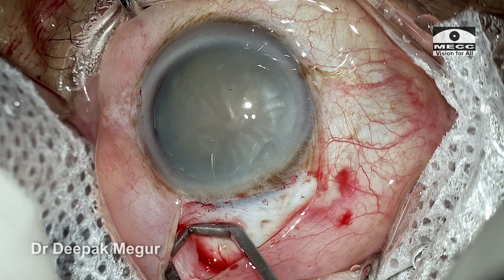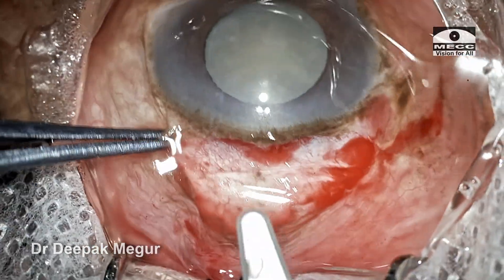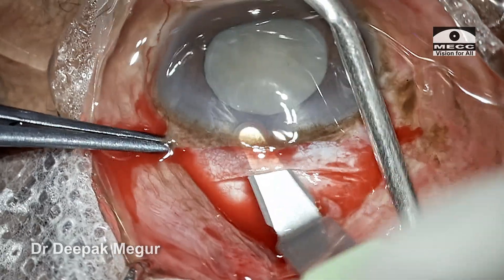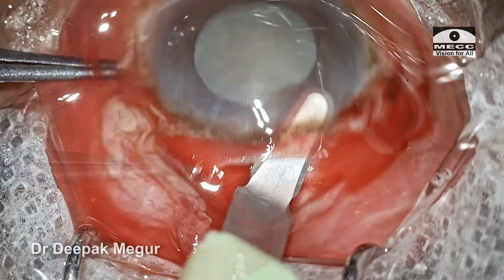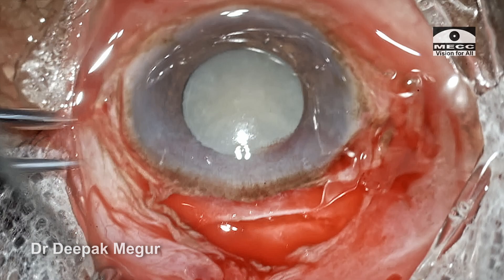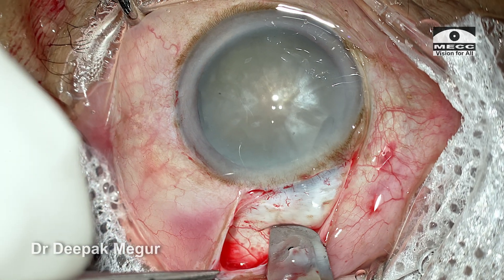The next key step, and probably the most important one, is to fixate the globe well. The traditional teaching has been to fixate the globe by holding the conjunctiva and the tenon at the left edge of the peritome. But most beginner surgeons traumatize the conjunctiva a lot and really struggle at this stage. Invariably, it leads to a lot of conjunctival tear, which would be pretty bad. So I am teaching my residents a new way to stabilize the globe — the posterior stabilization groove.